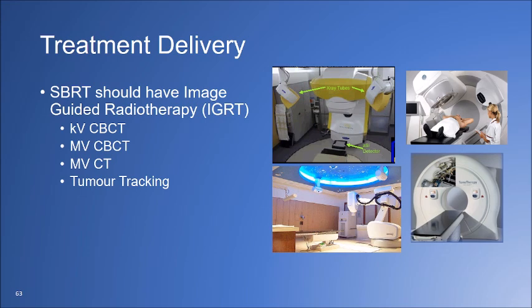So how do you deliver the treatment with the LINAC for SBRT? You need to have some tracking system. Some 10 years ago, during a visit to one of the centers in Australia, I saw them doing SBRT with cone beam CT.